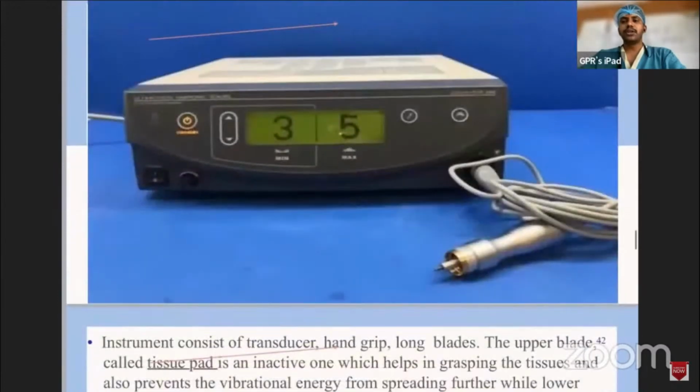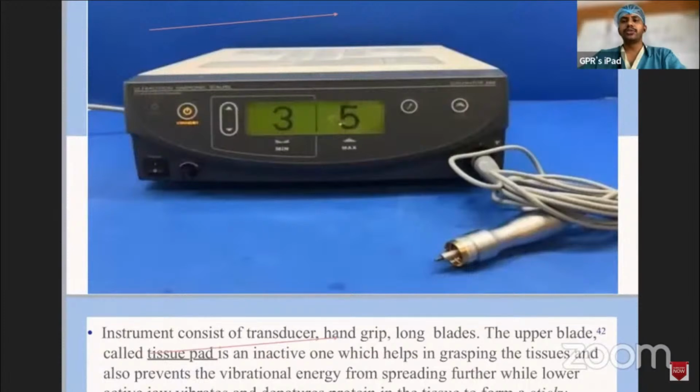So this will be the classic harmonic energy source, and the cable that has been used for it, and it has two different modes, 3 and 5. 5 will be more for cutting and less for coagulation, whereas 3 will be more for coagulation rather than cutting.